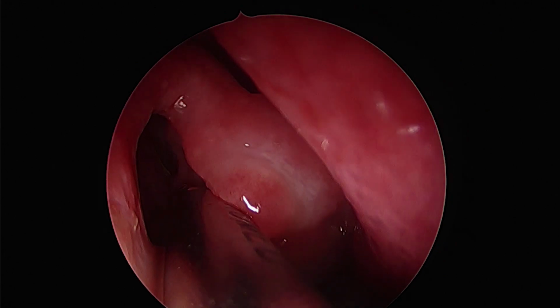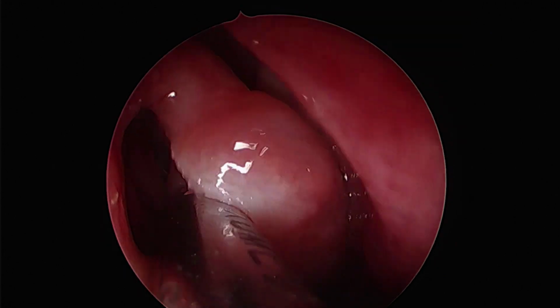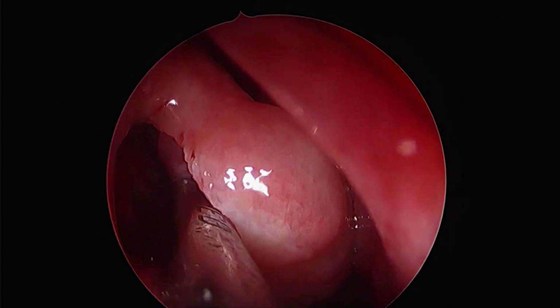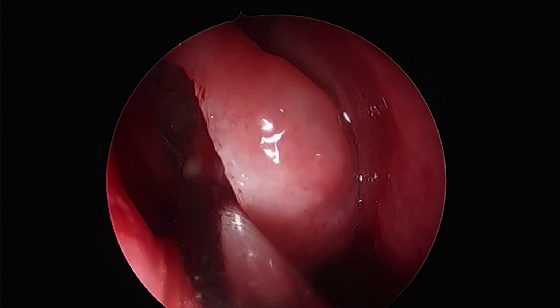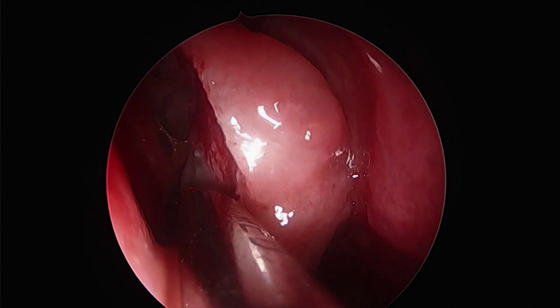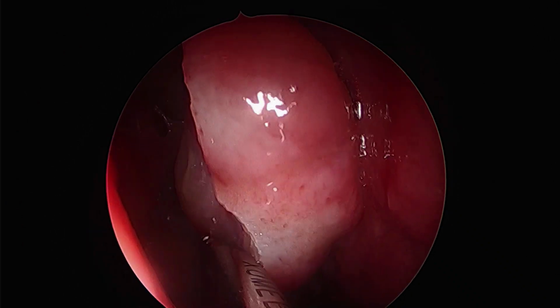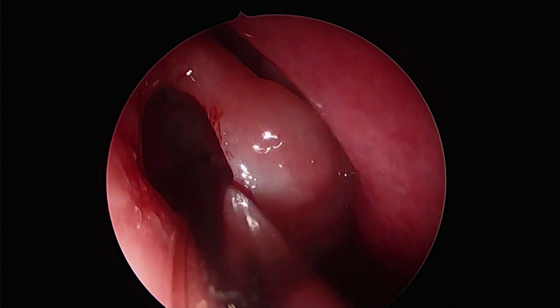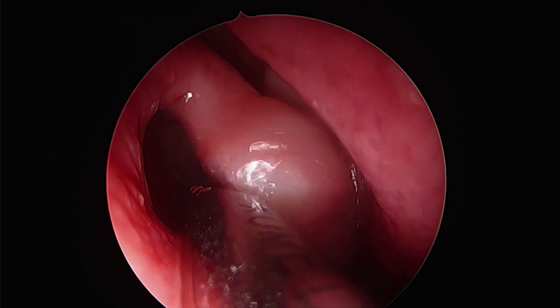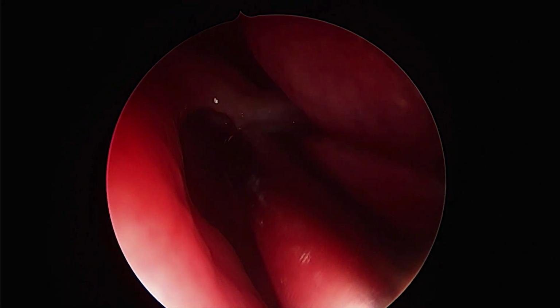This is followed by reduction of the middle turbinate to see if we can manage with just reduction of the middle turbinate, or do we need to proceed with a formal partial turbinectomy. We can see that it is all inflamed mucosa. A shaver blade rather quickly improves our overall access into the middle meatus, which was previously impossible.